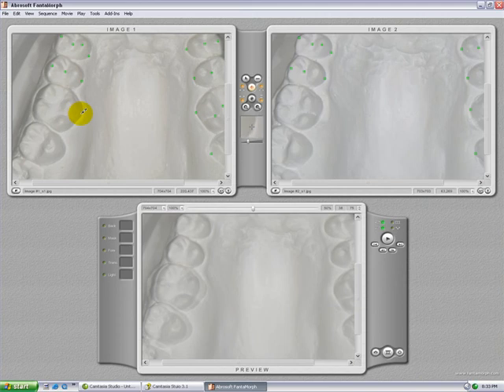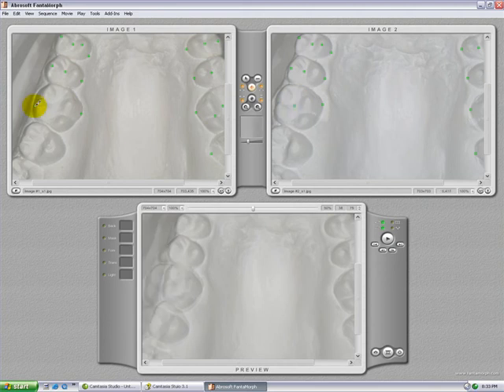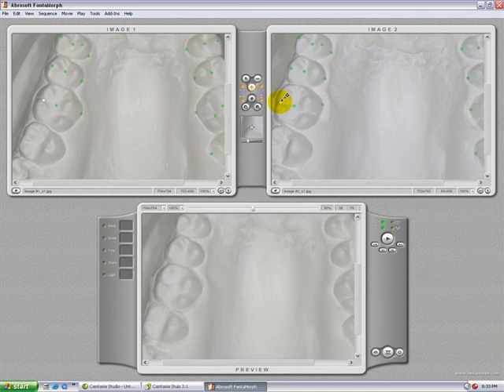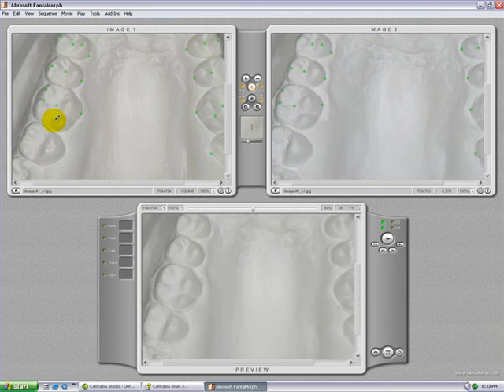Make sure we cover all teeth in this case. This is a case where the treatment was done with a removable and a fixed expansion appliance, followed by straight wire.